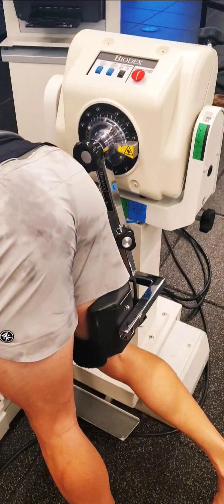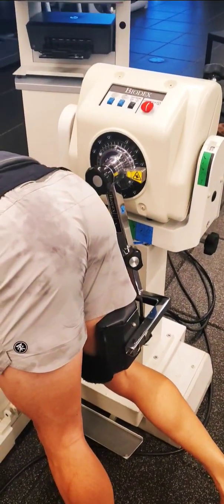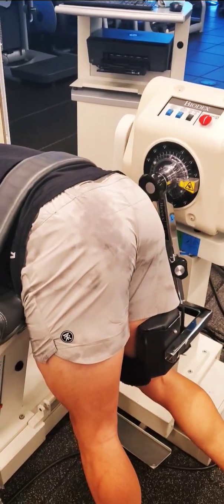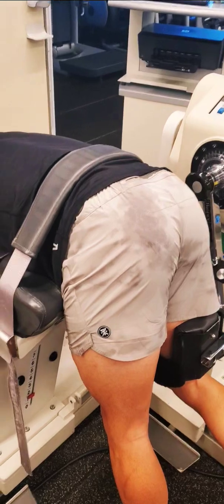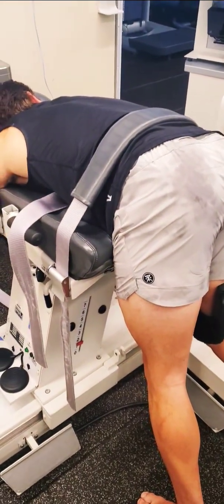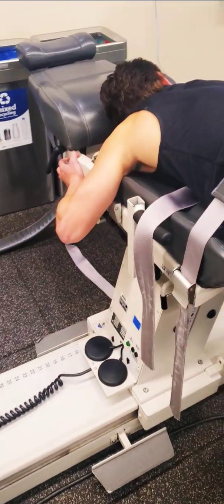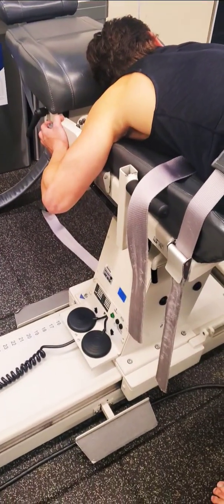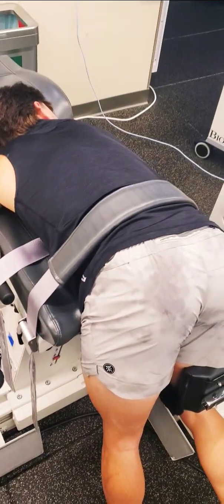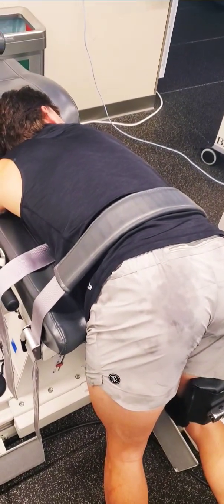Part two in our hip extension isokinetic testing. We now have the patient in place. We're going to utilize the donkey position, where the individual is going to be bent over the edge of the table. Hands are going to grasp the metal frame for stability, and we have one strap over the lower back.